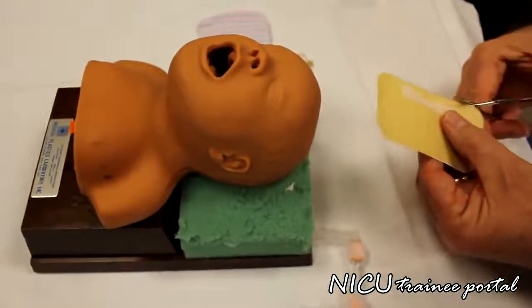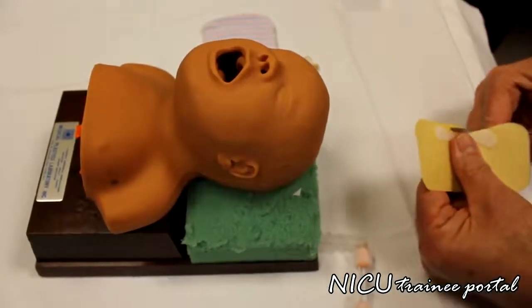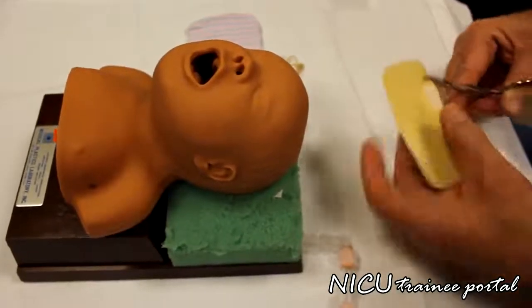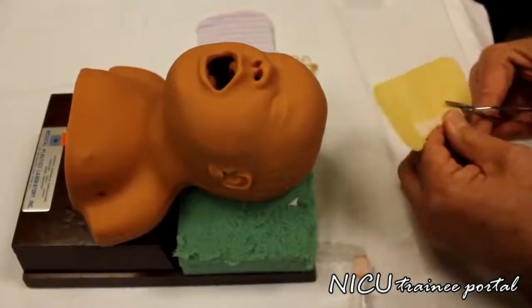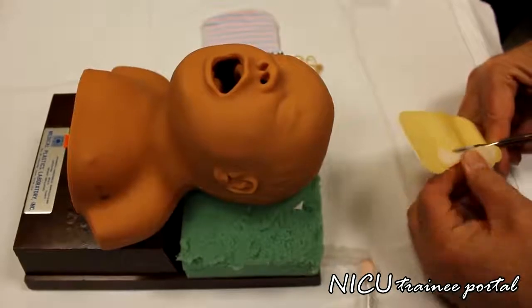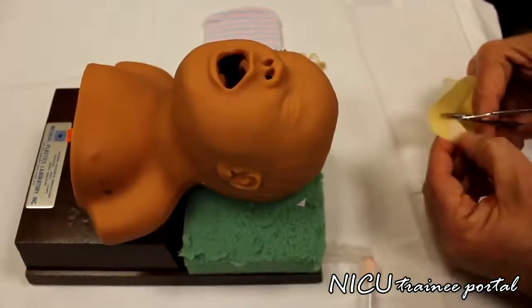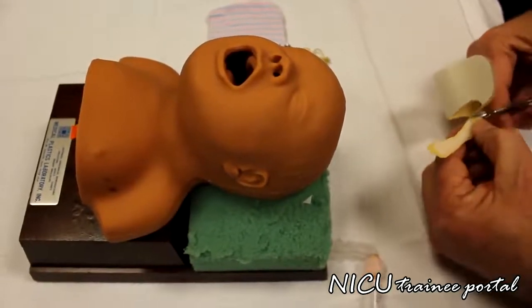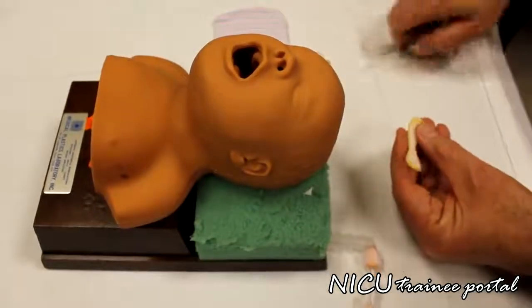There's different versions, but this is what I do, and I find it easier. You can see, trim, maybe leave a 1/16 of an inch all the way around. Sometimes I run a little extra tab on the bottom. Make sure you be out on each cheek side, and about a 1/16 of an inch all the way around. And there you go.